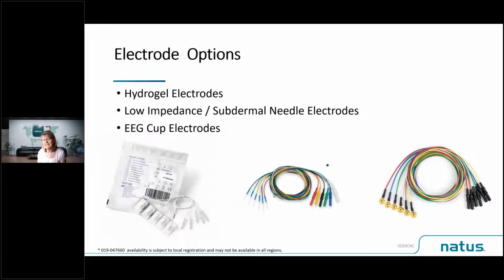And with low impedance needles, because they're sitting underneath the skin, subdermally, we expect the impedance to be really between 0 and 2 kilo ohms, so much better impedance value with the needles.